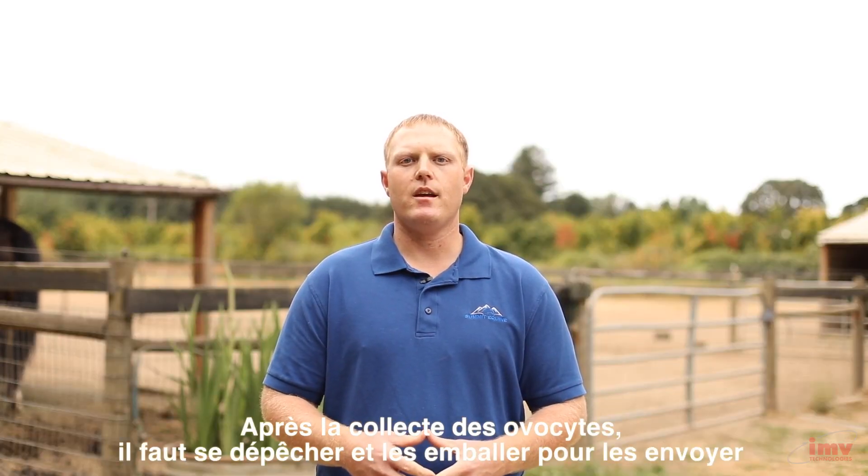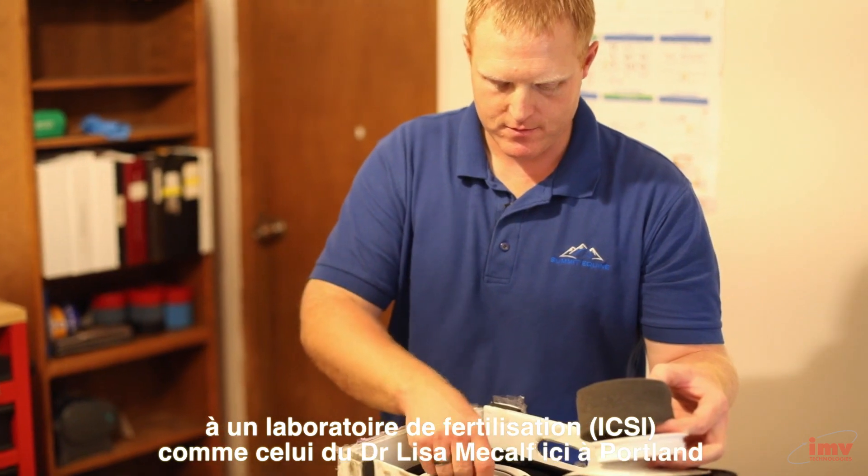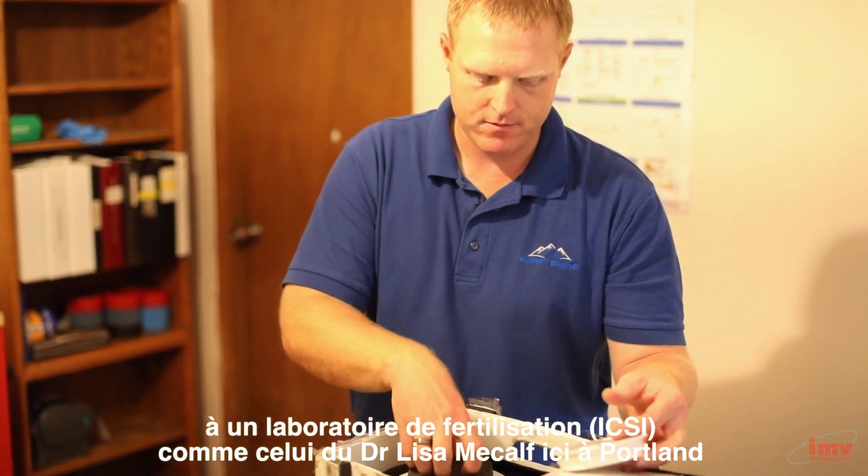After collecting our oocytes and grading them, we'll go ahead and package them for shipment to an ICSI laboratory such as the one that Dr. Lisa Metcalf maintains here in Portland.